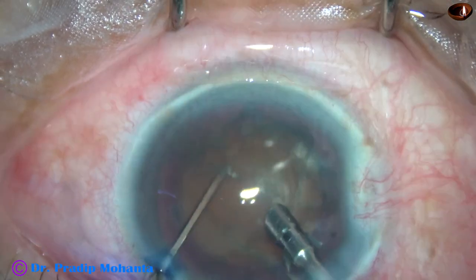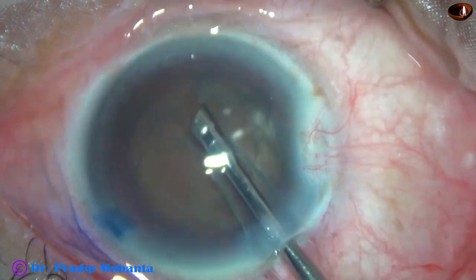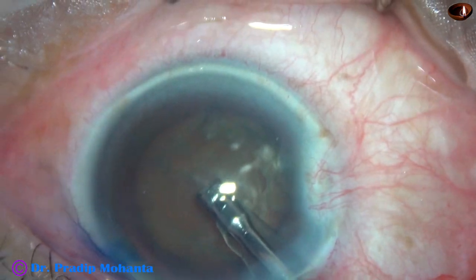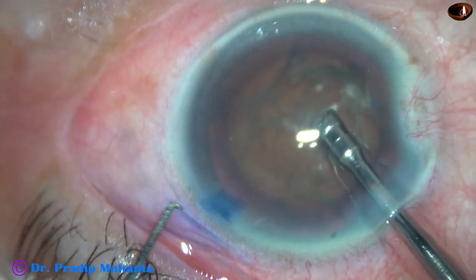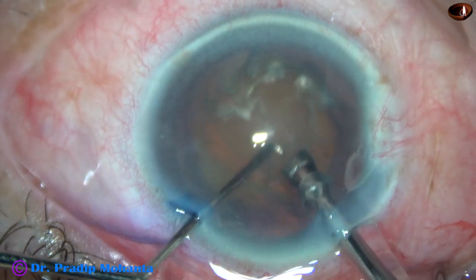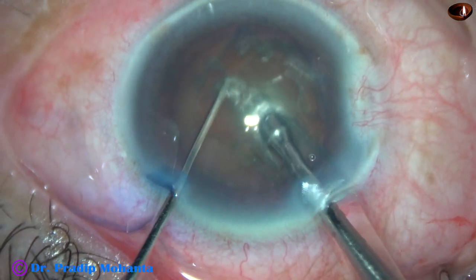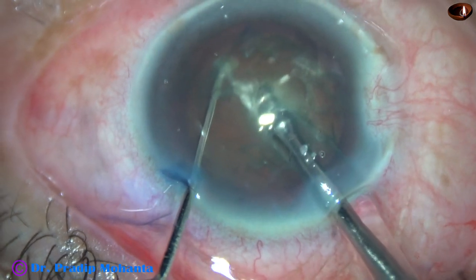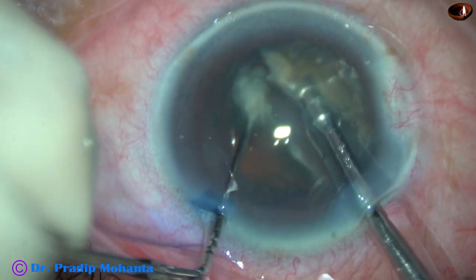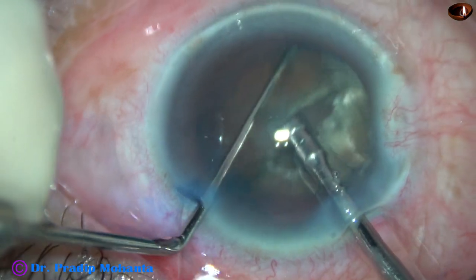After aspirating some cortical lens matter, I turn the handpiece and make the bevel up towards the cornea. Now I use the chopper to push the nucleus little down and bury the tip into the substance of the nucleus just in front of the main incision. Now it goes through the nucleus towards the opposite equator. Since it is travelling under the surface, I call it submarine chop. I am happy that this technique has become quite popular in many places.